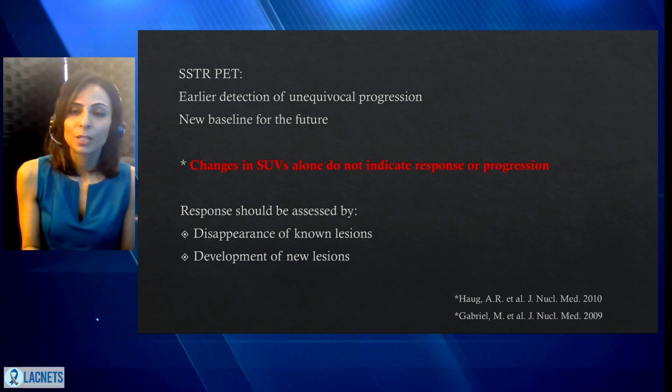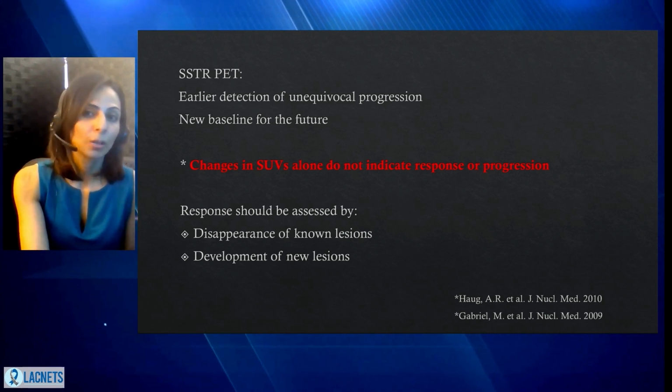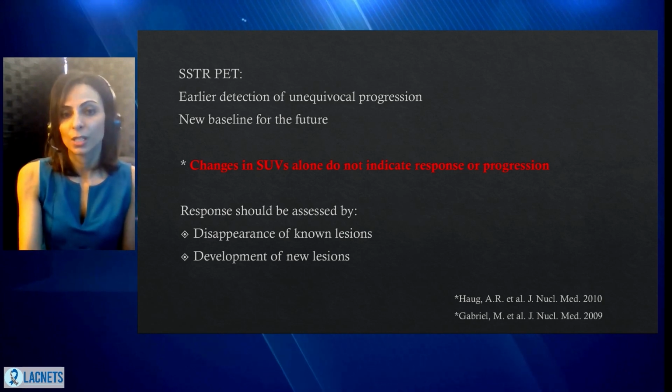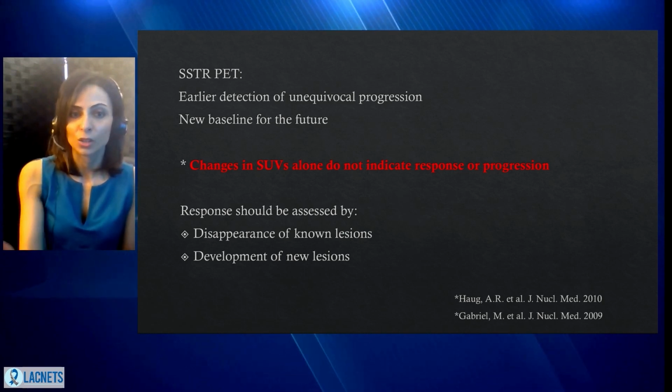And for somatostatin receptor PET, the most important teaching point that I'm going to mention today is that we should not use the change in SUVs alone to indicate response or progression.